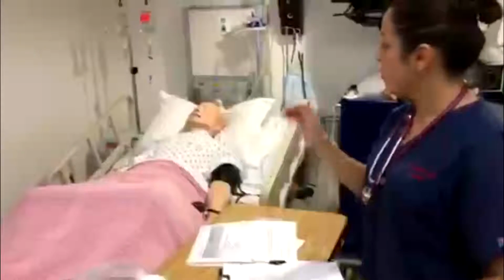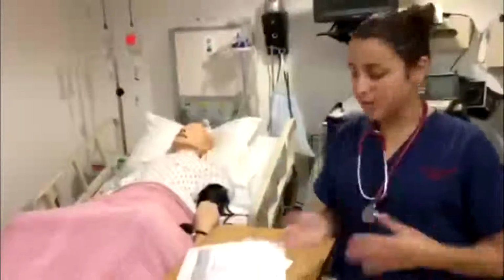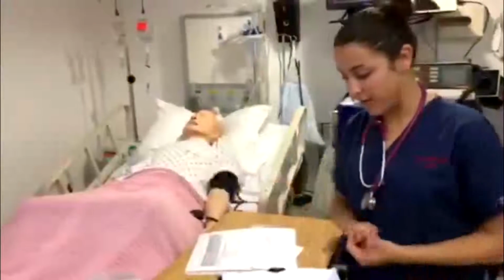So I just want to make sure to put that label on the tubing to let other nurses know who take care of Mr. Sweetheart the procedure that has been done so they can carry on with their care.